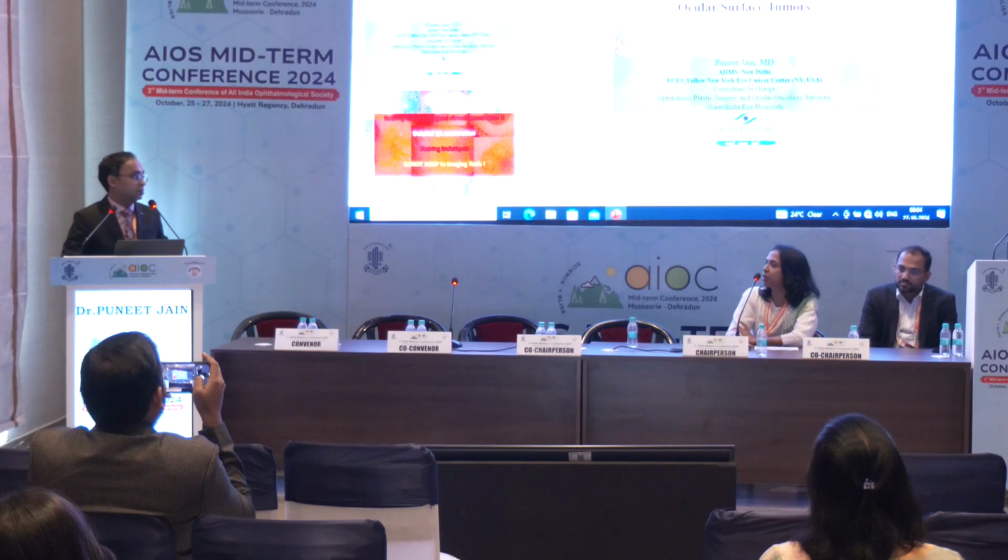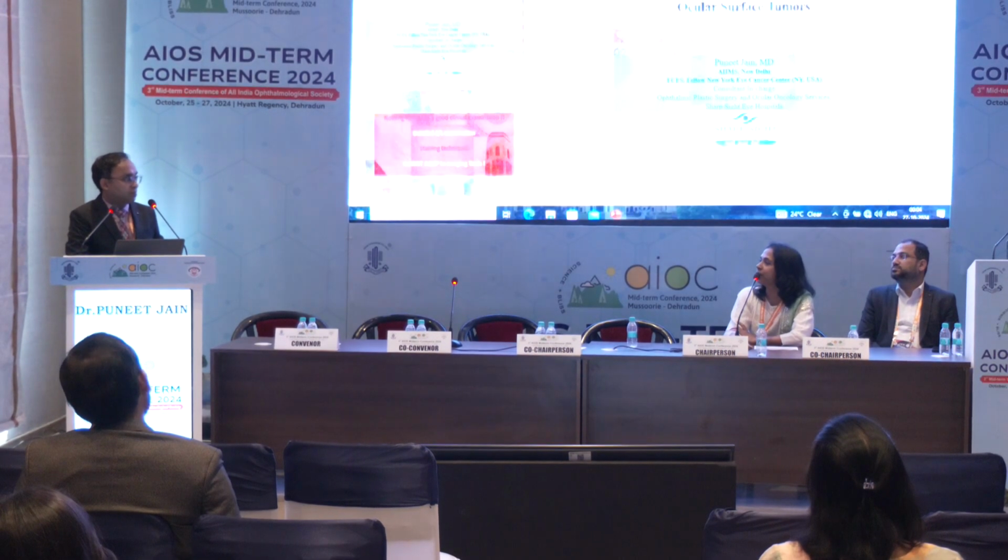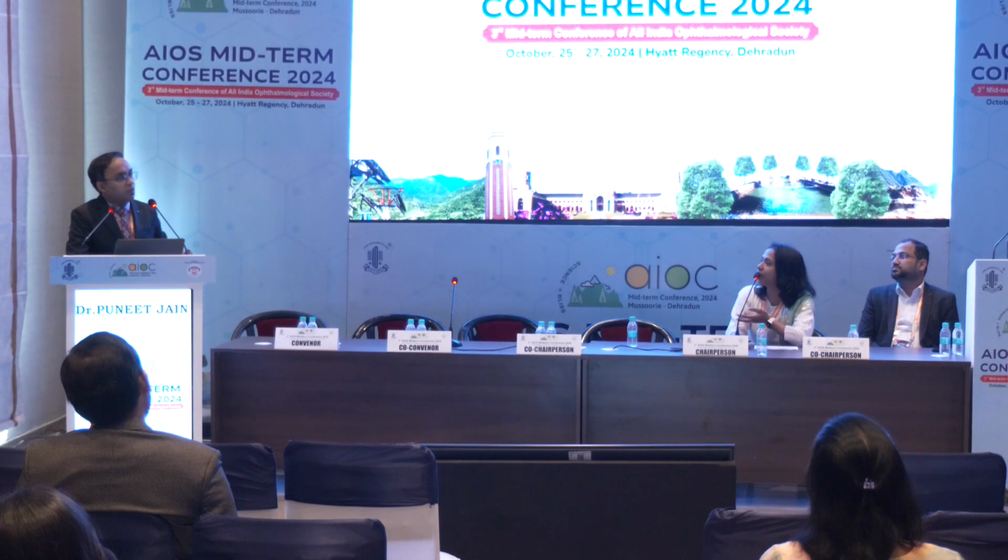Okay, any inputs on the use of ASOCT in limbal dermoids, the depth, the grades, and when do you go in? If the limbal dermoid is, so we're talking about the corneal part, right? So you have to take a decision whether you can operate yourself or you need a patch graft or the help of a cornea specialist or your colleague. You usually see a lot of shadowing on dermoids as well. So it is very difficult.